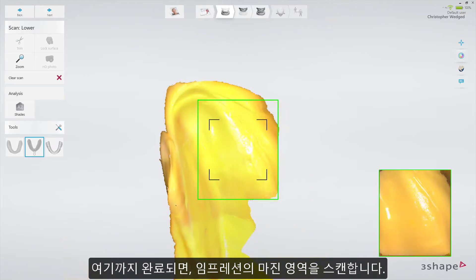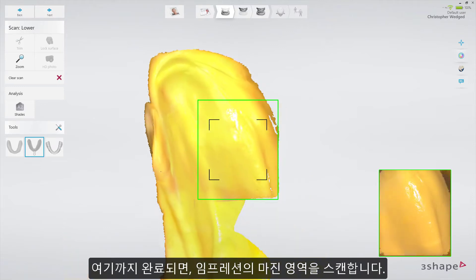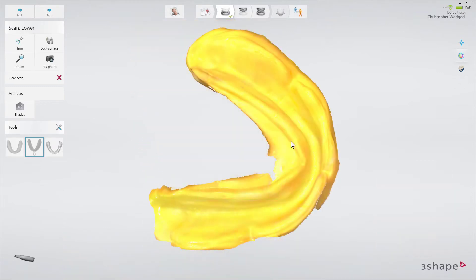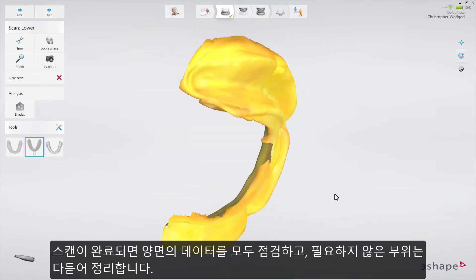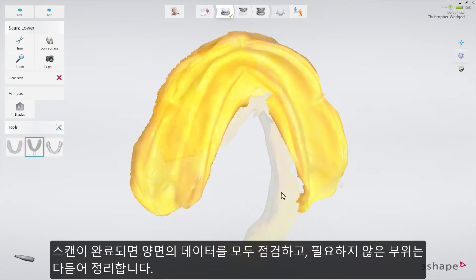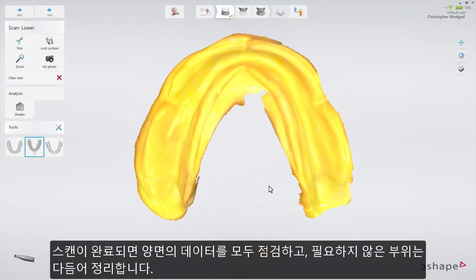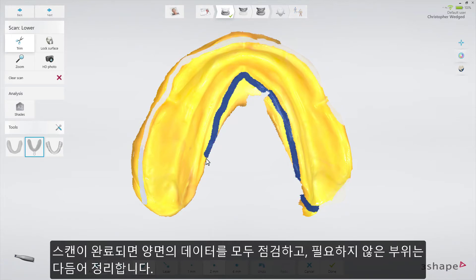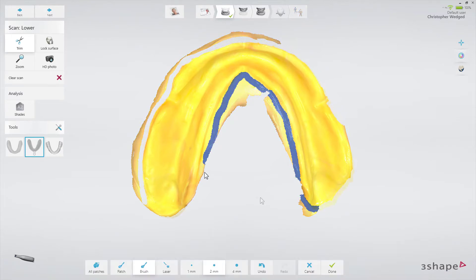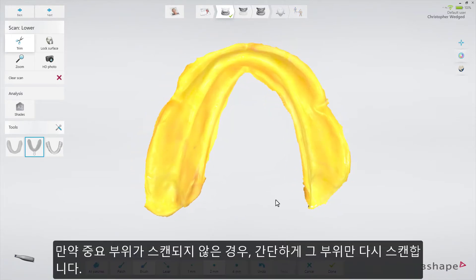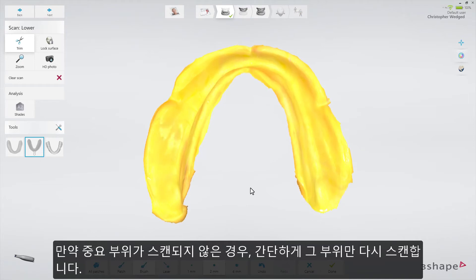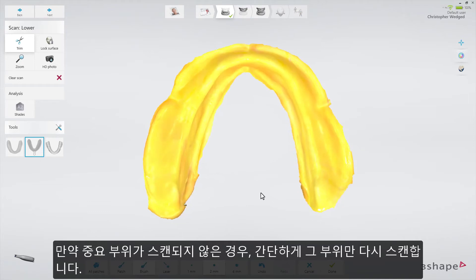Once that is completed, proceed with the marginal areas of the impression. When scanning is complete, you can inspect the result on both sides and prepare the scan by trimming unnecessary parts. If an important area is missing, simply start scanning that area again.